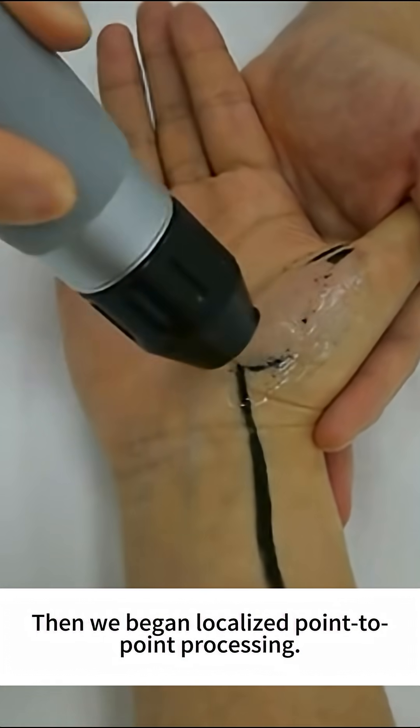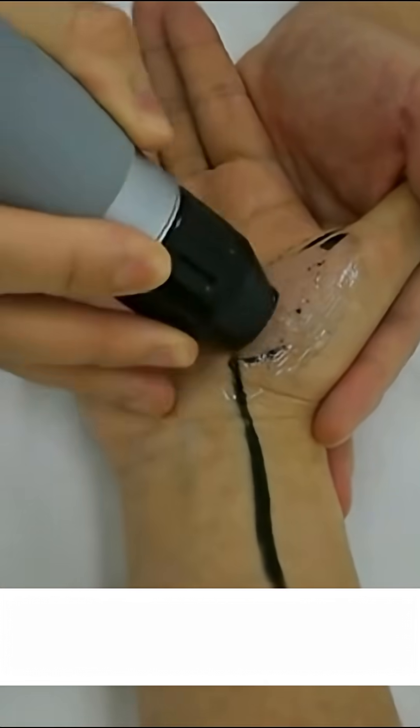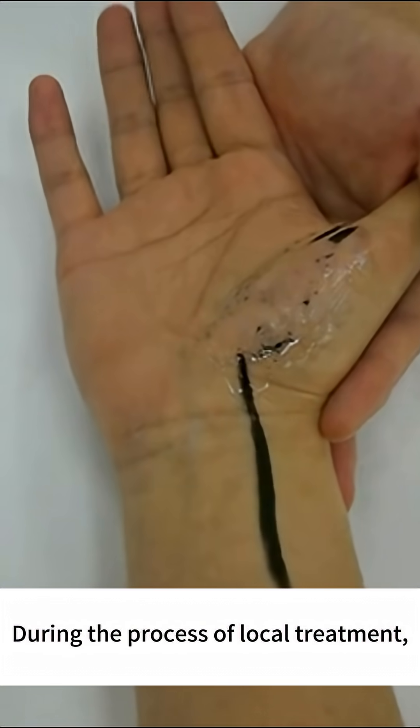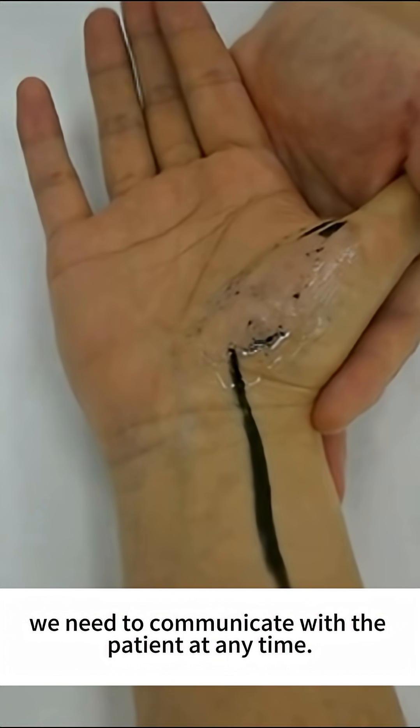Then we begin localized point-to-point processing. During the process of local treatment, we need to communicate with the patient at any time.